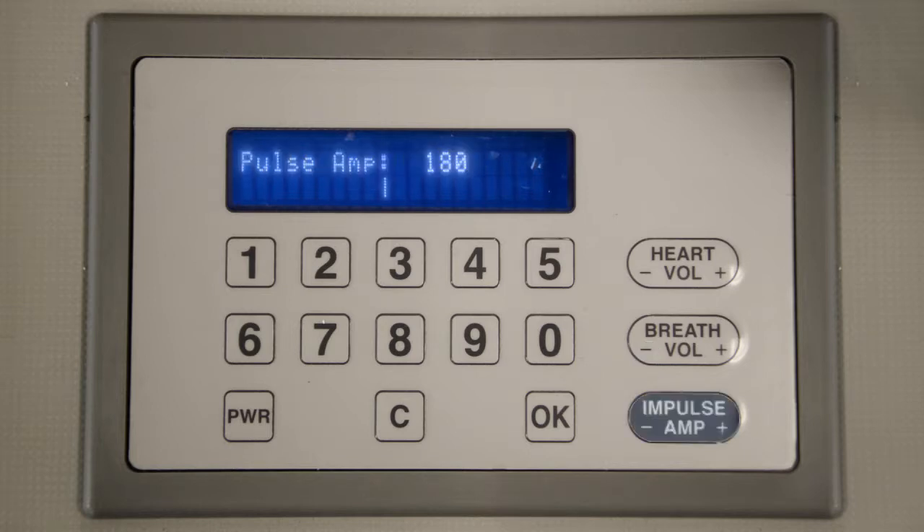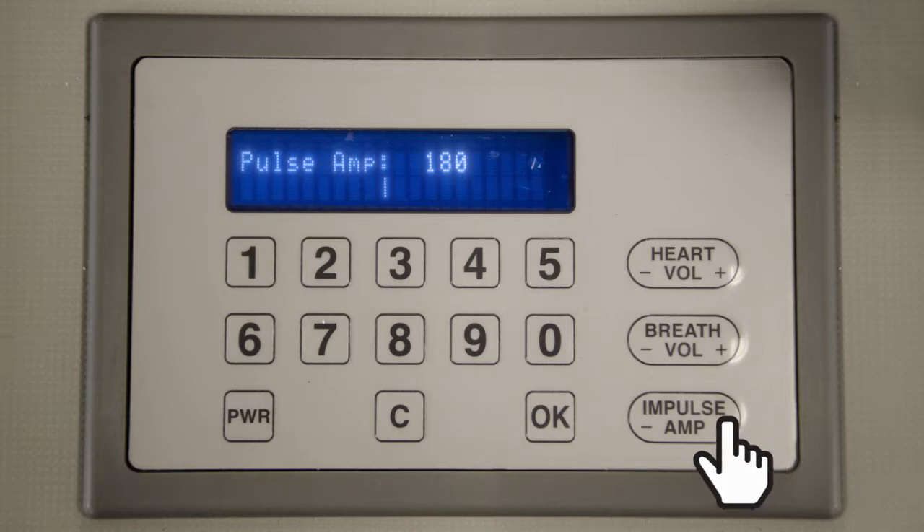The impulse amp keys control Harvey's impulse amplitude. Change Harvey's amplitude by pressing the AMP plus or minus buttons.